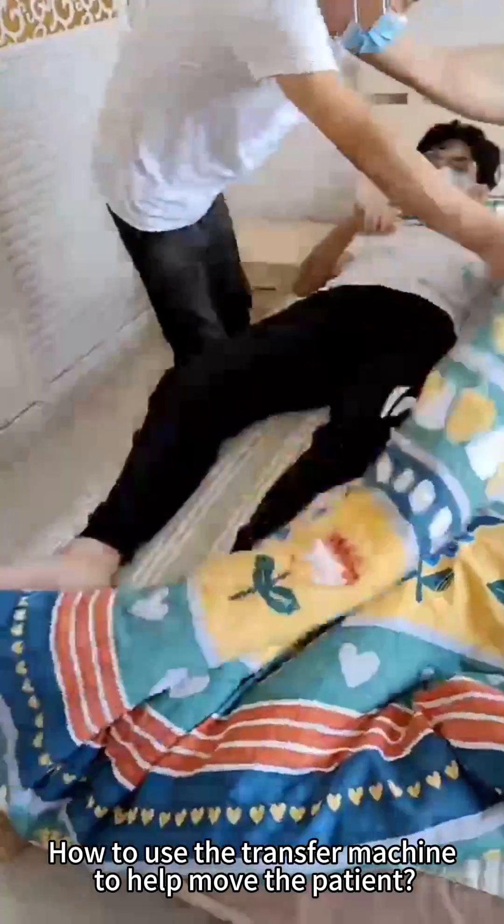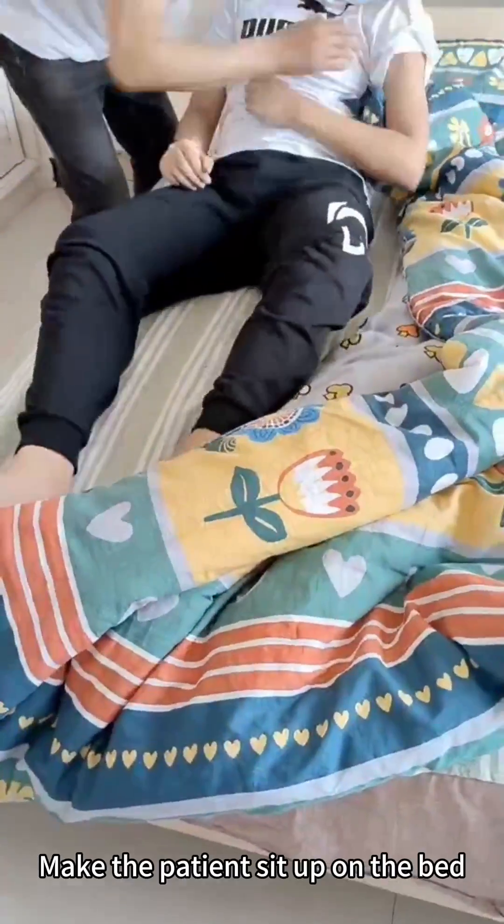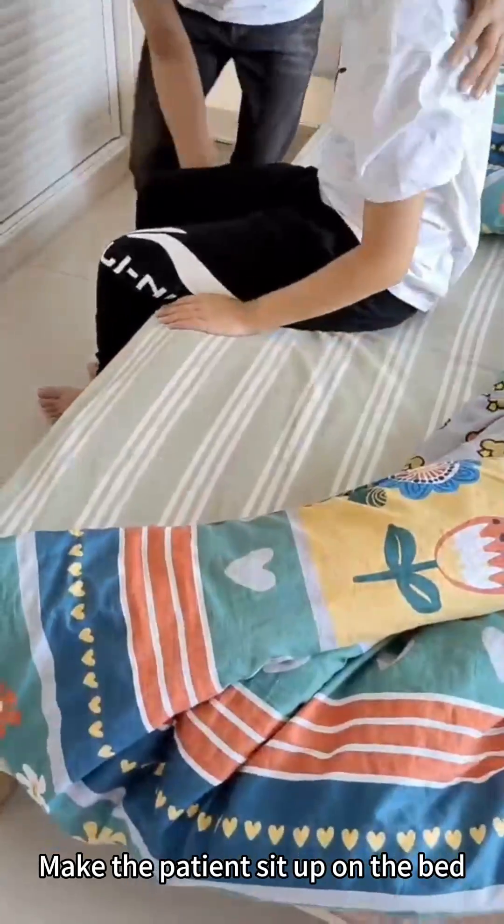How to use the transfer machine to help move the patient. Make the patient sit up on the bed.